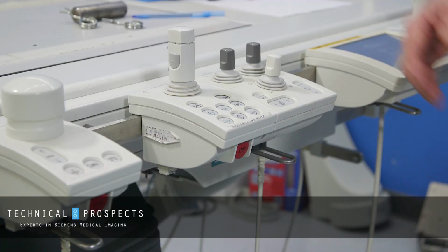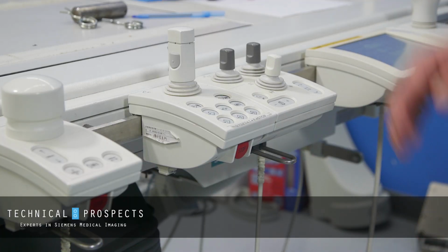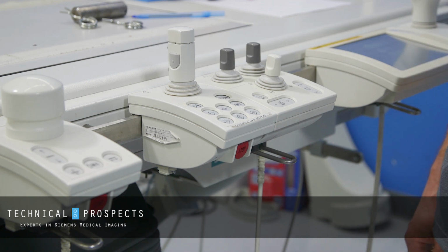Today's tip is about resetting the stand control module in all mechanical controllers by a very simple action from the operator side, and after the reset, the system will be working again like normal.